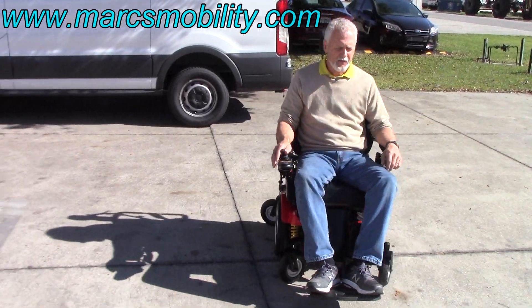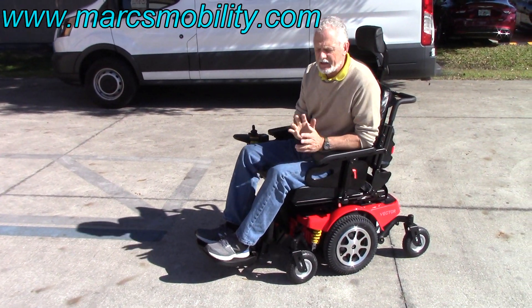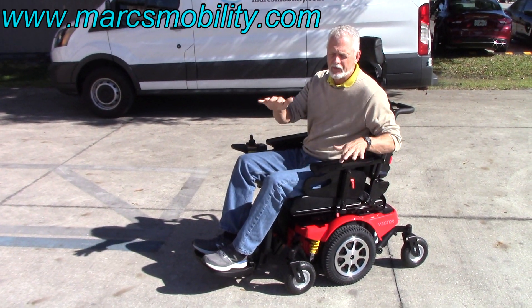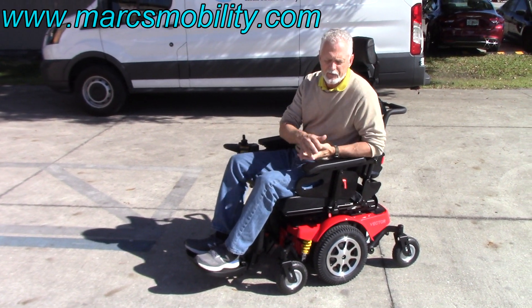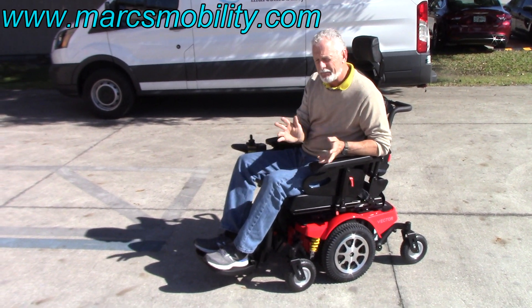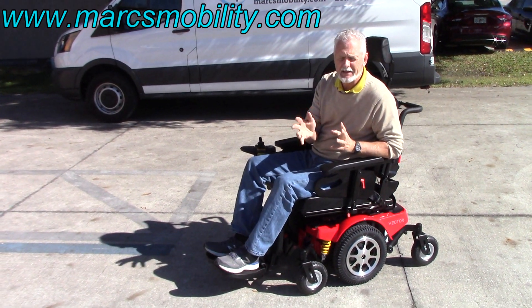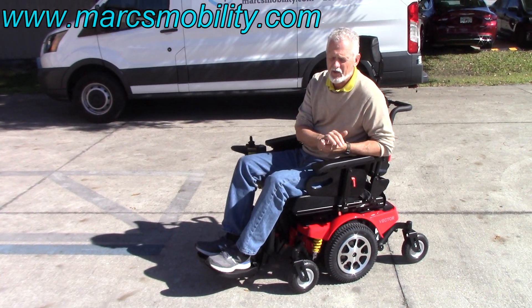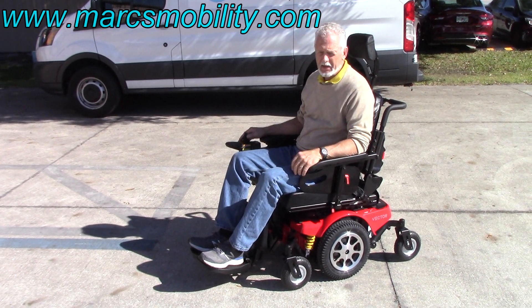This is the Meritz Vector power chair by Meritz — electric tilt, electric recline, electric legs. We went through the grass with the front and rear suspension, and it went through fairly decently with no problem and plenty of power. Very smooth, it probably goes about five to five and a half miles an hour — definitely a fast, very comfortable chair, and it's ready to go.